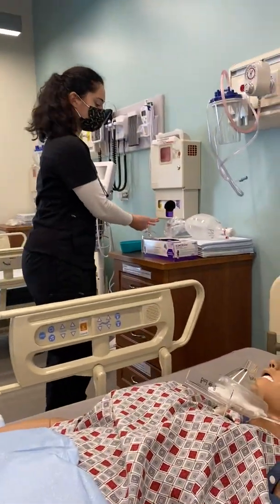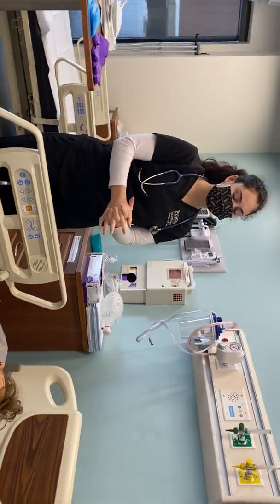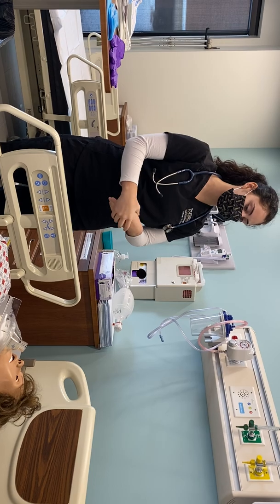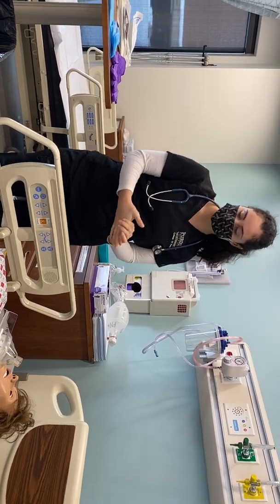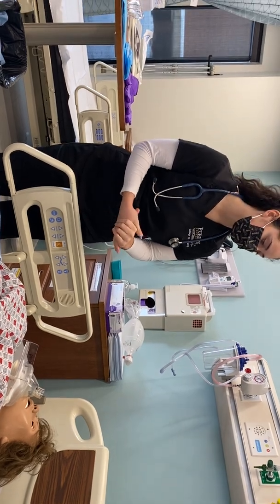Hello, Mr. Jackson. My name is Jenna. I'm going to be your student nurse for today, and I saw your chart before I came in and noticed that the doctor has requested for a tracheostomy suction and care to be done. So now that I said that, can I please see your ID badge? Thank you. Can you say your full name and date of birth? Thank you. Do you have any allergies I should be aware of?